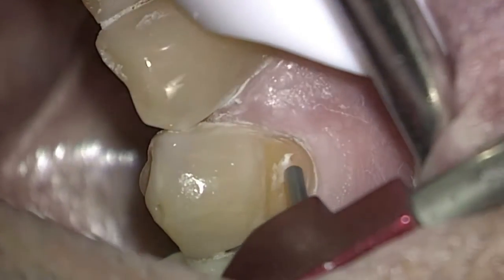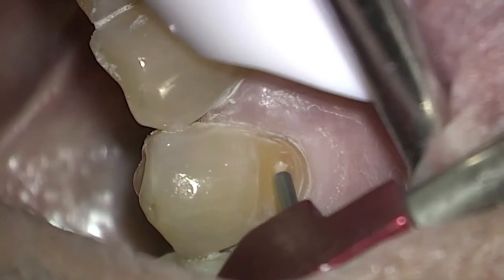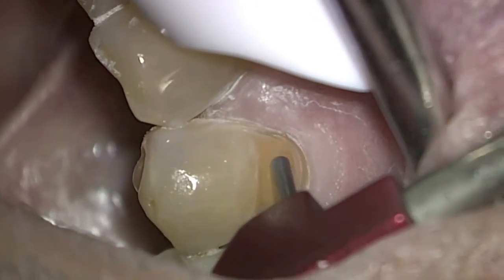It is strong enough on its highest settings to actually cut right through teeth. I've just about removed all of the old bonding, and then I'm going to clean all the surfaces around it. But as you can see, I'm not removing any enamel with this power setting.